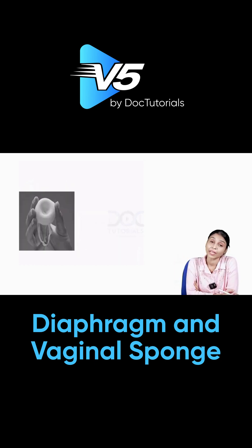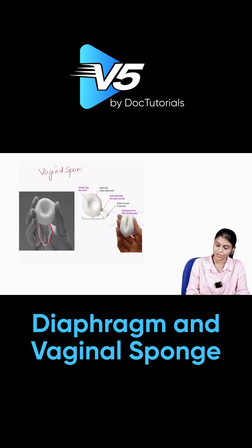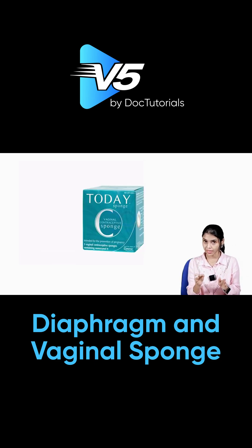Can you identify this? It looks somewhat like a diaphragm, but it is not a diaphragm — it is thicker than a diaphragm, softer than a diaphragm, and you will also find a loop on it. This is the vaginal sponge.